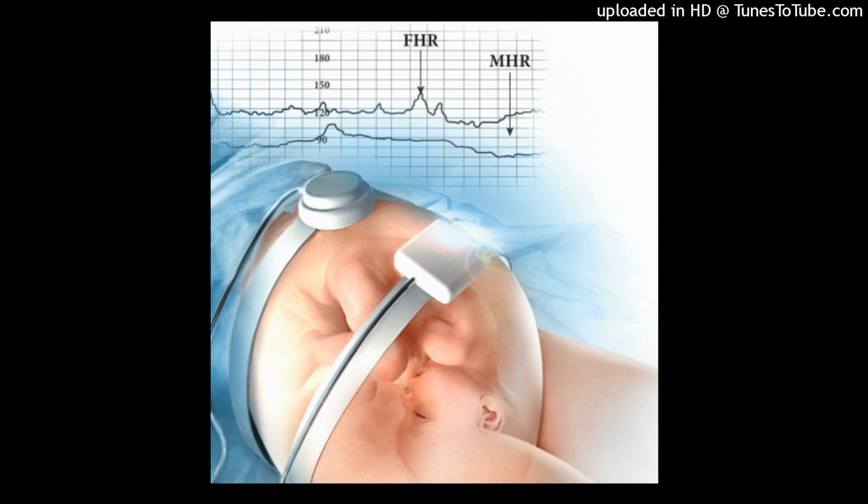During the intrapartum period, clinicians need to understand and acknowledge 3 fundamental concepts to using a systematic approach to fetal monitoring. 1. Standardized definitions, or nomenclature, that is used to define FHR and UA characteristics. 2. Interpretation, or the physiologic significance of the FHR and UA characteristics. And 3. Management, or the clinical response to FHR and UA characteristics.